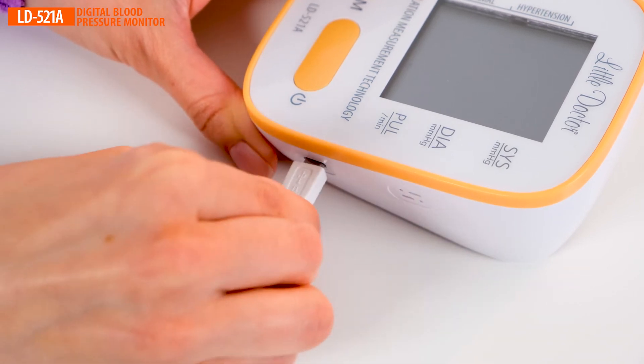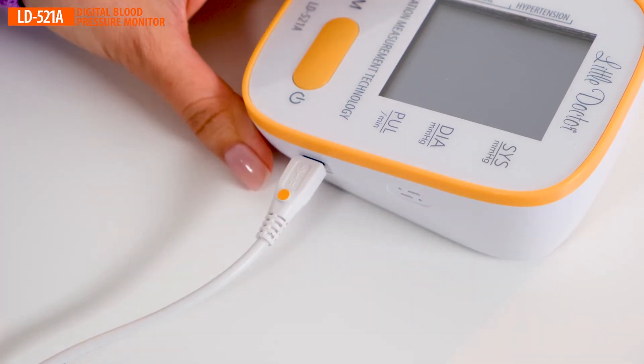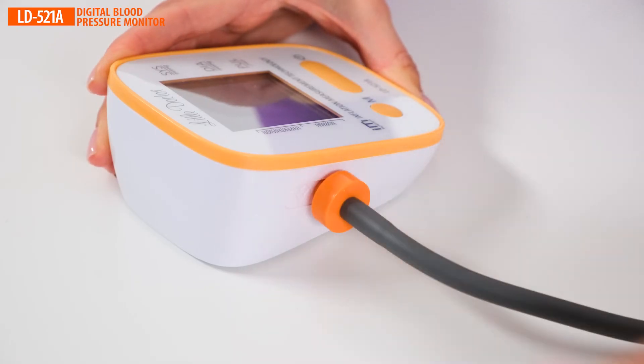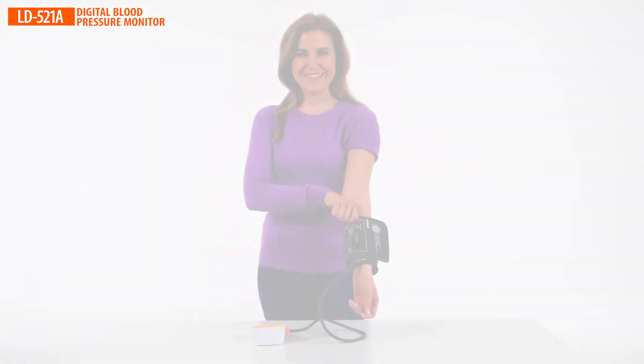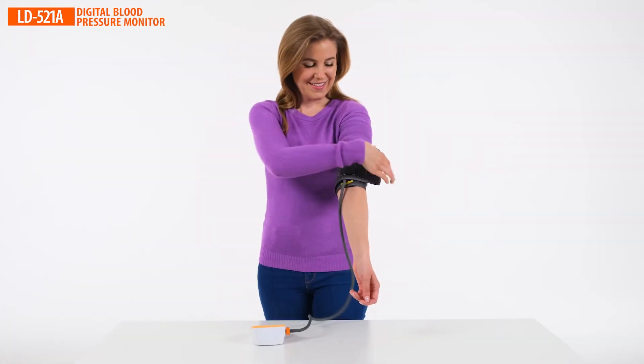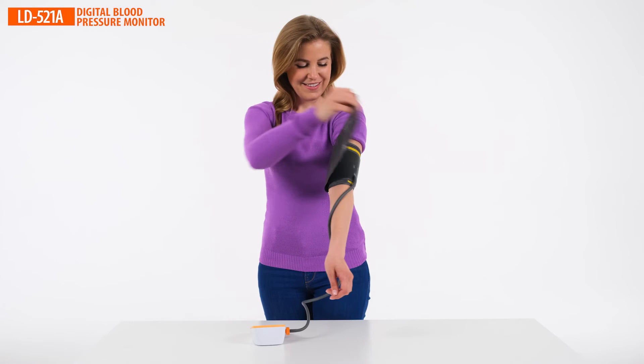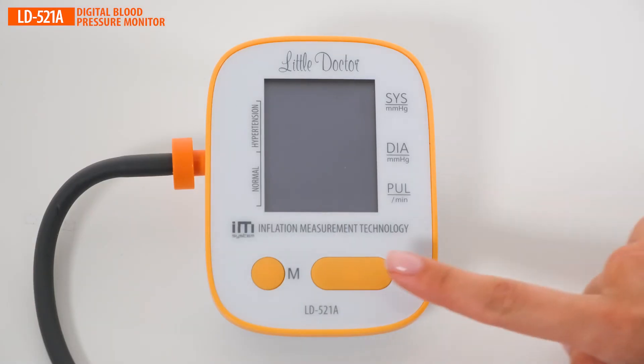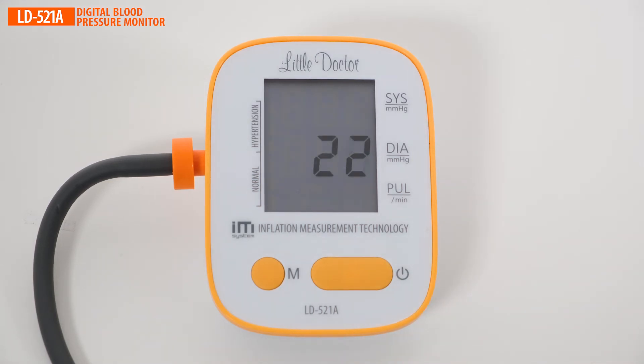It is very easy to check your blood pressure with the LD521A. Measurement procedure: 1. Put the cuff on your upper arm as shown. 2. Press the large button — the device will start to inflate the cuff, taking measurements concurrently. After a few seconds, the result will be displayed on the screen and stored in memory. The hypertension indicator tells if your blood pressure is too high according to WHO recommendations.